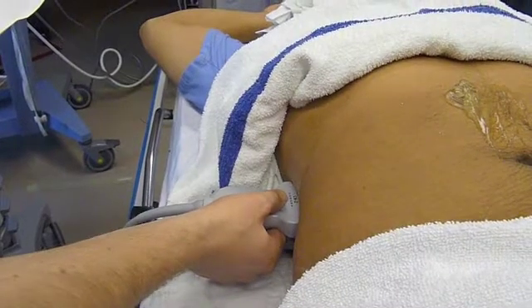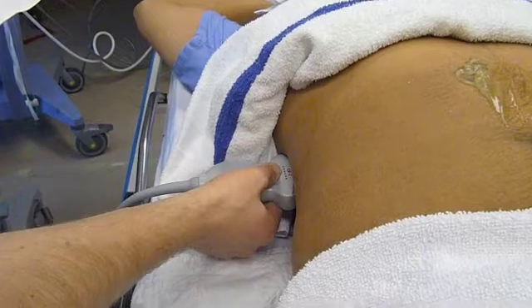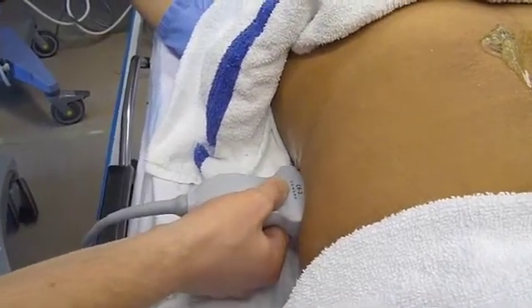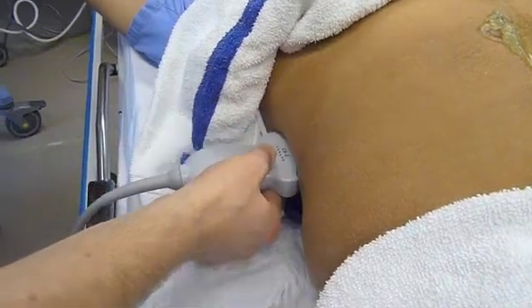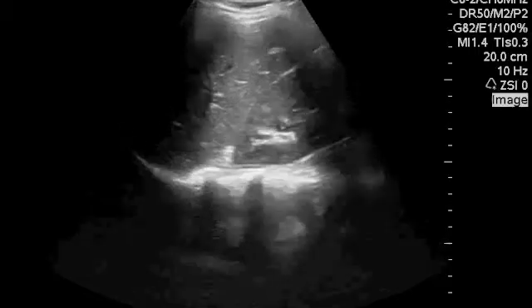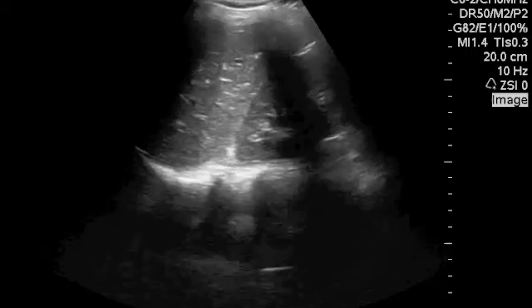Our second movement is to move the probe in the longitudinal direction, while not changing its AP position at all. The goal here is to see the hepatorenal interface. On the screen, you see as I move towards the head, I get a better view of the diaphragm. And as I move down towards the feet, I see the interface — and there's the tip of the liver. That's the caudal end of the interface. We need to see that.